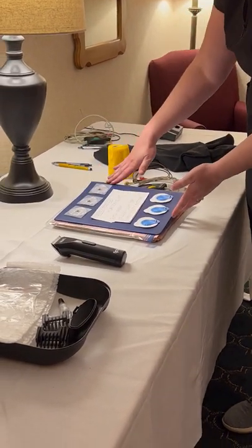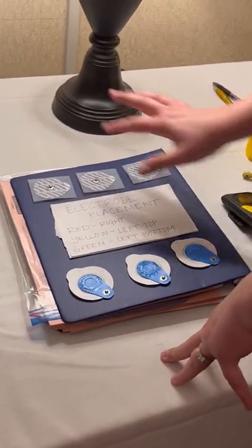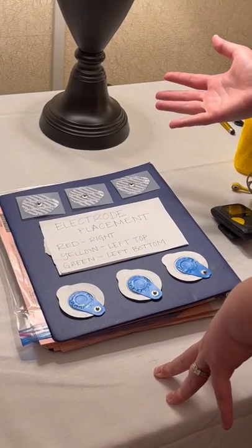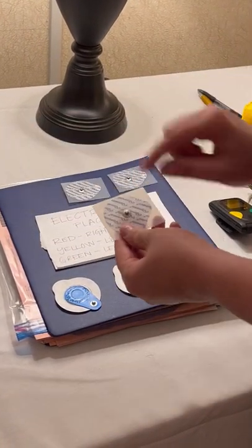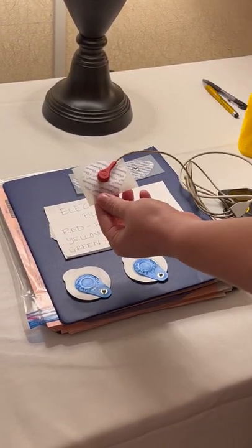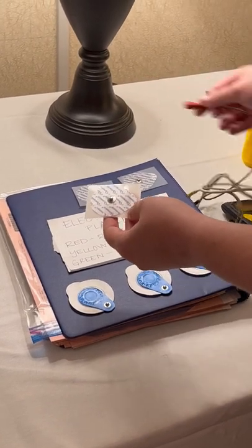These are the two different types of electrodes — we have two different styles here, but both accomplish the same task. It just depends on which one you might get in the mail. These electrodes have the spot where the actual lead attaches to, so they clip on in place. They will be removed, but you have to put a little bit of tension on them to remove them.